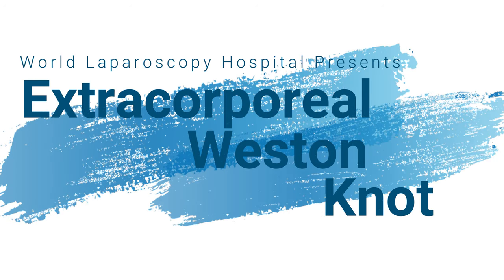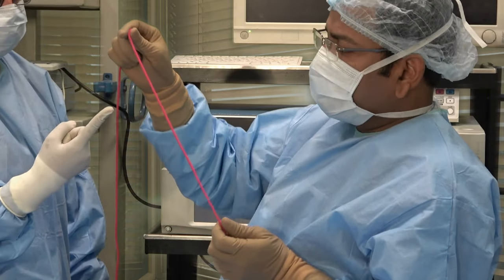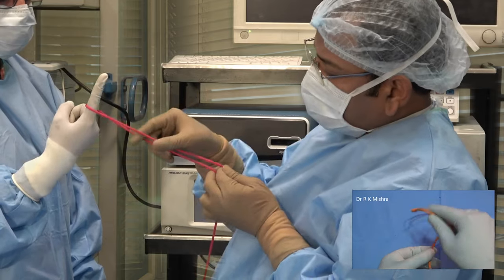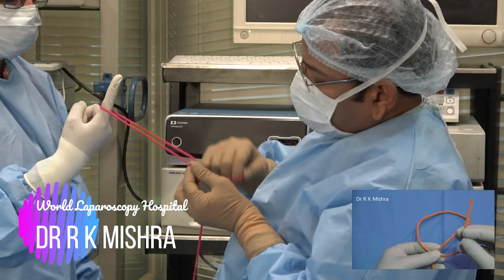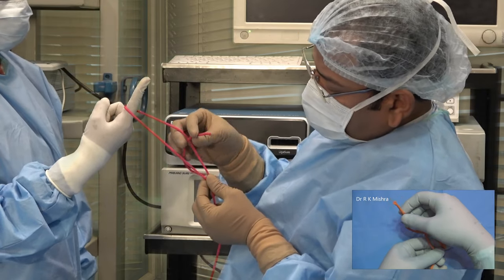Hello friends, today we will see the extracorporeal Weston knot. The Weston knot was started by arthroscopic surgeons and it doesn't need a knot pusher. You will put the shorter limb above the longer, and then a single hitch will be taken.